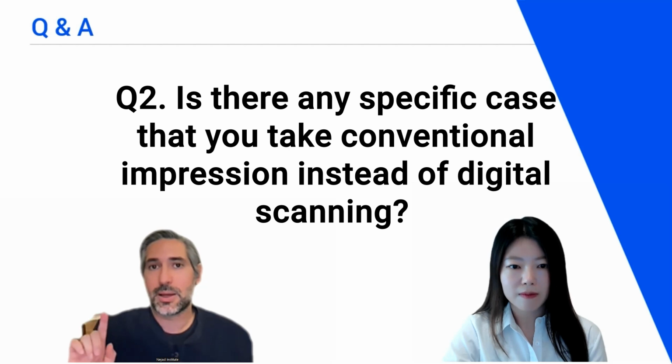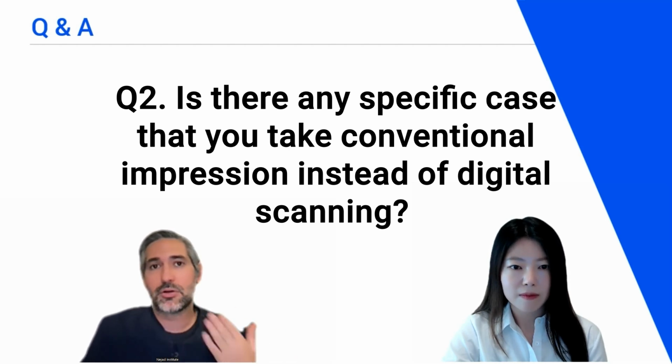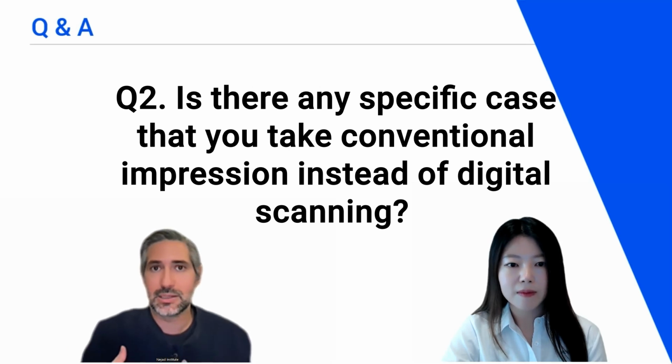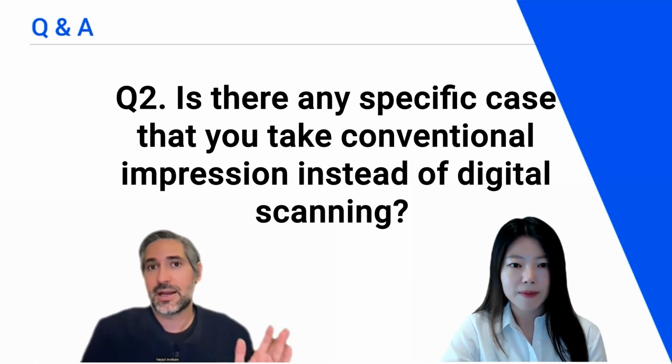My digital scan is my backup. And it also has some of those things I just showed you, like the measuring tool. Imagine you're doing a full mouth case. I'm still checking for reduction. I'm still checking that I have enough reduction for my veneers. In fact, I take my design or my wax up and import it as additional data so that I can use it to verify I have enough reduction space to achieve the design I want. And then I still have the scan as a backup.